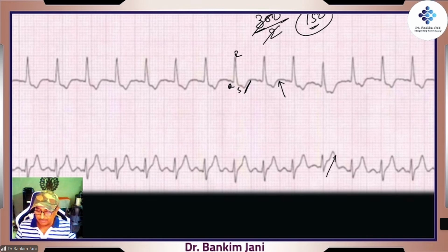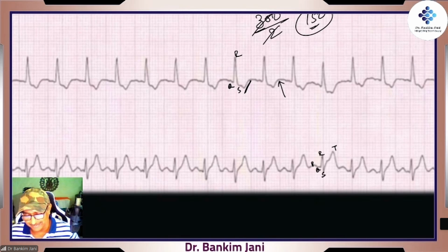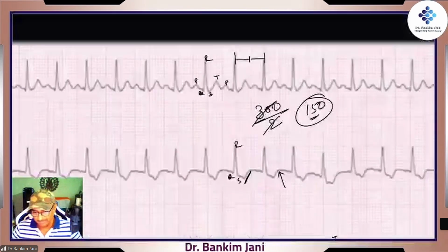And in this, see what happened. This is your P wave. That's the Q. This is your R, S, and the T wave of your patient is spiking even more than the R wave. No, he is not an athlete. This is myocardial infarction, heart attack. It is in progress.